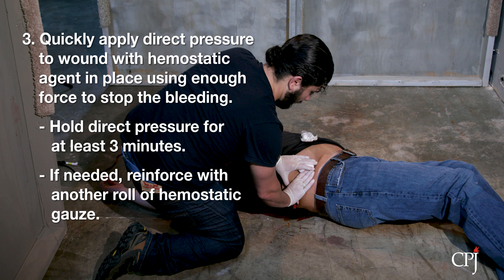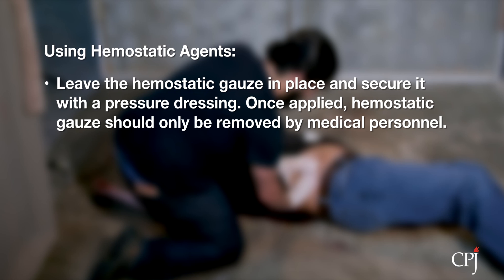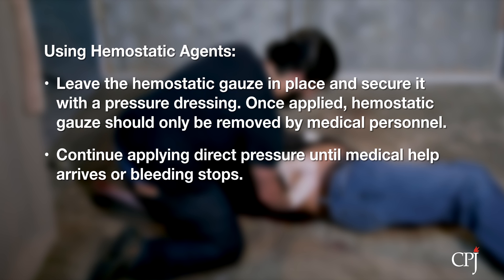If needed, reinforce with another roll of hemostatic gauze and hold pressure. Leave the hemostatic gauze in place and secure it with a pressure dressing. Once applied, hemostatic gauze is not to be removed except by medical professionals. Continue applying and holding direct pressure until medical help arrives or bleeding stops.